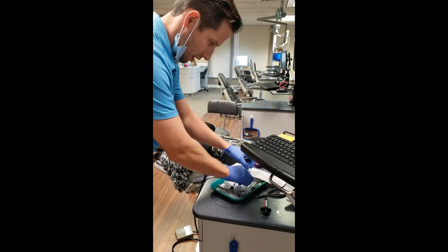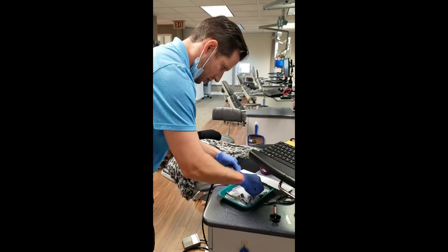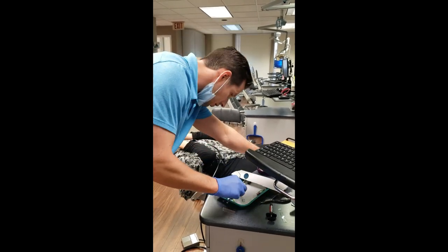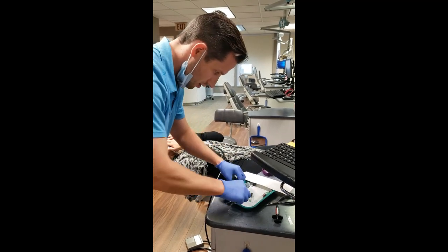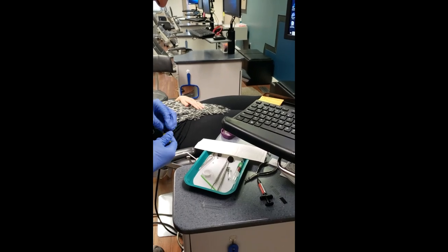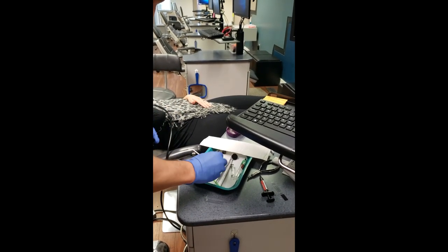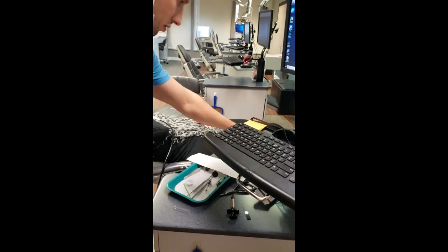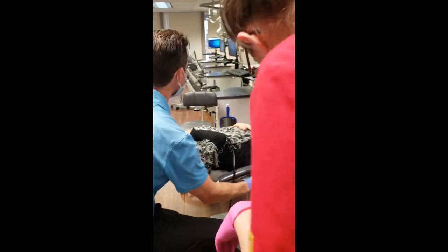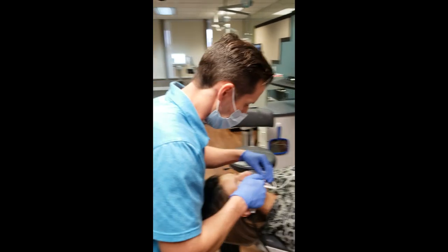On the tray, you basically just need the mirror and the bonding stuff. Anytime you bond, one thing I don't see here is a curing light - so I'm going to make sure we have that. Anytime we're doing any type of bonding, we're going to etch.